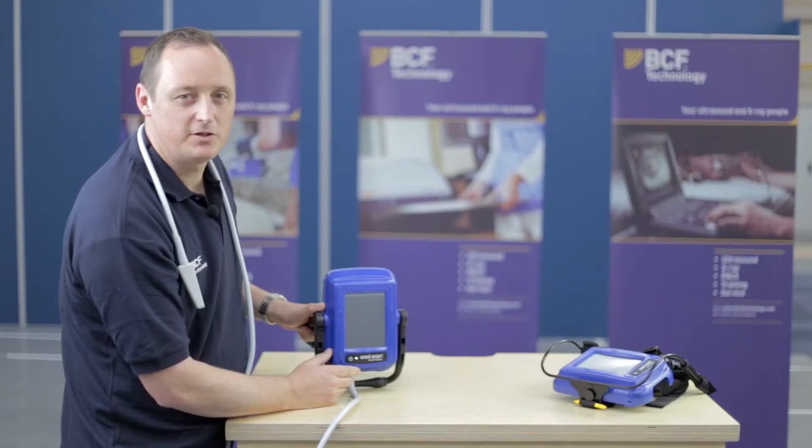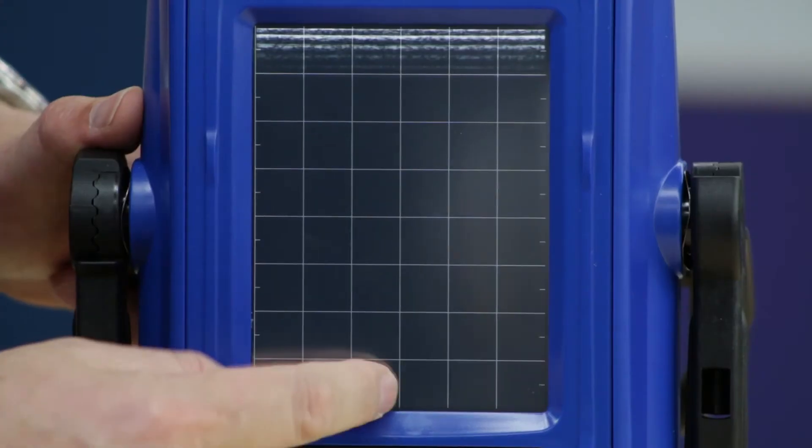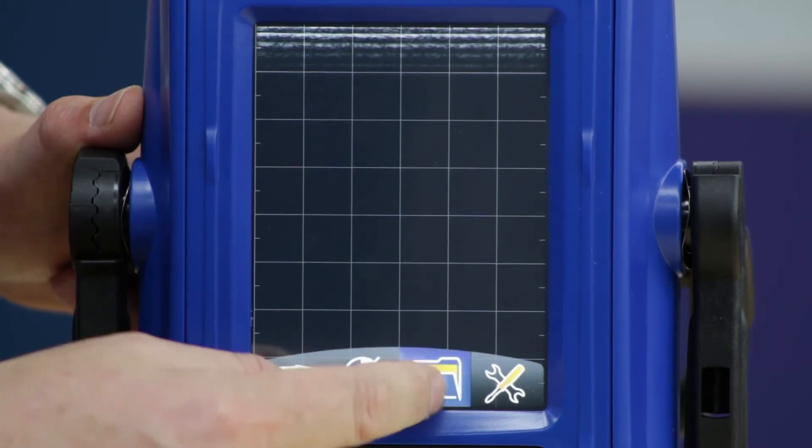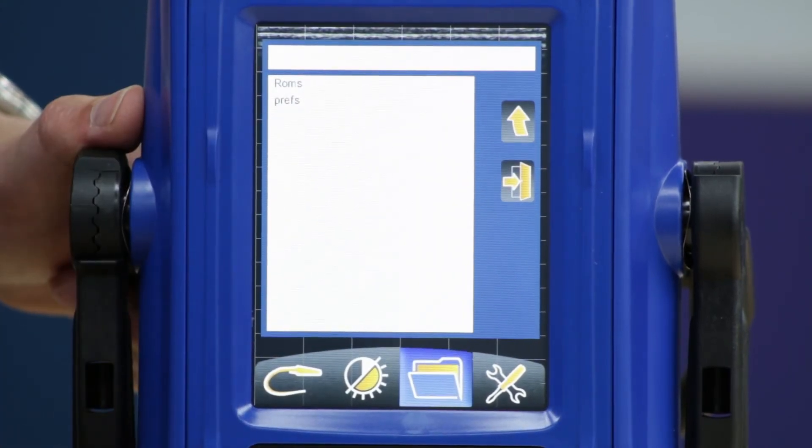With any smart device, you'd want to save the patient details. This is easily done by pressing your touch screen, pressing the folder option, and then editing the patient details.